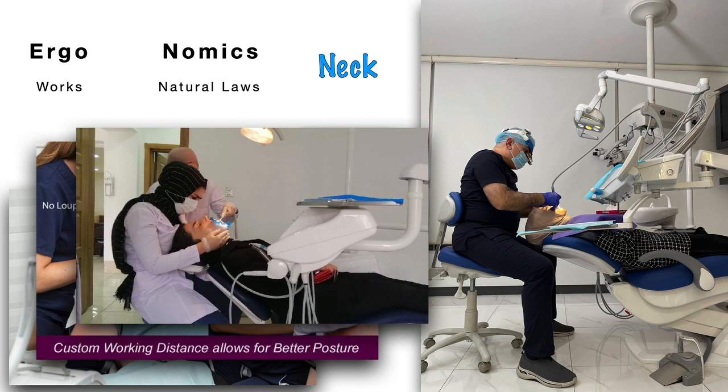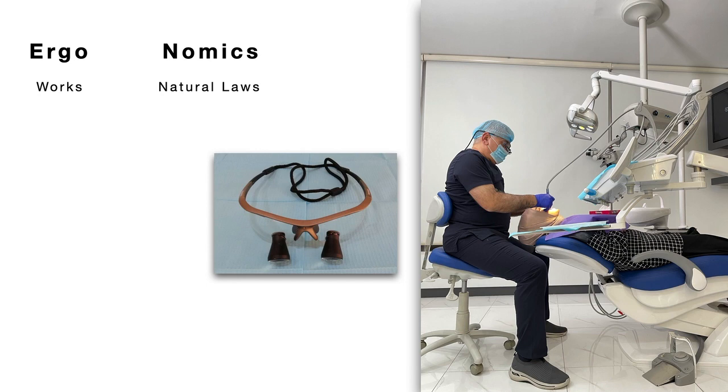Then I will jump to the other kind of magnification, which is a customized TTL loop. So it's 3.2. Here, as it is customized, it has a better working distance, more than 45 and less than 50, between 45 and 50 centimeters of working distance. So it will help me to correct my posture, better than the previous one, which is a 4x prismatic loop. But still I do bend my head, and in a long time this leads to physical disorder.